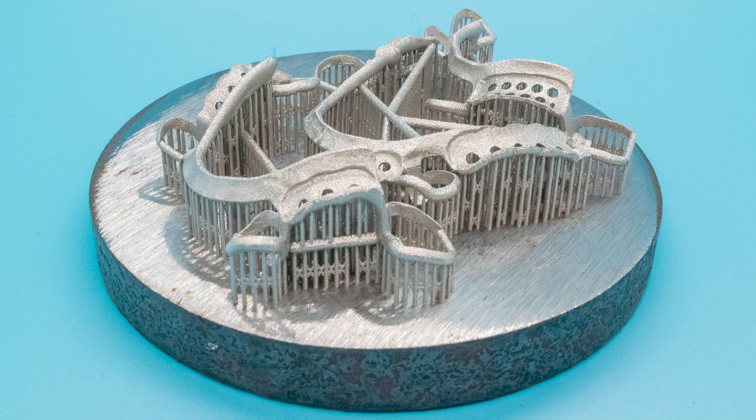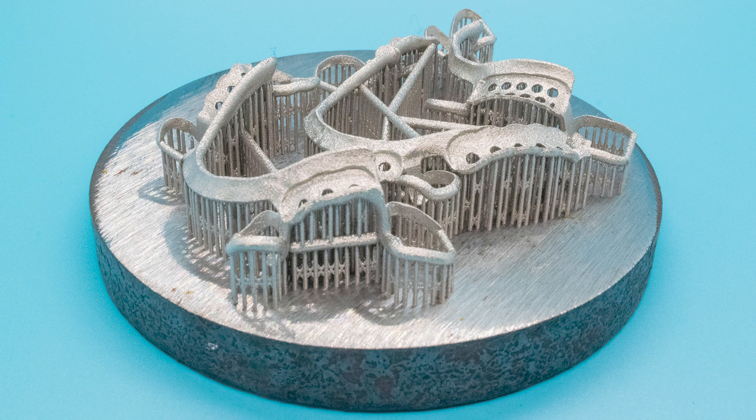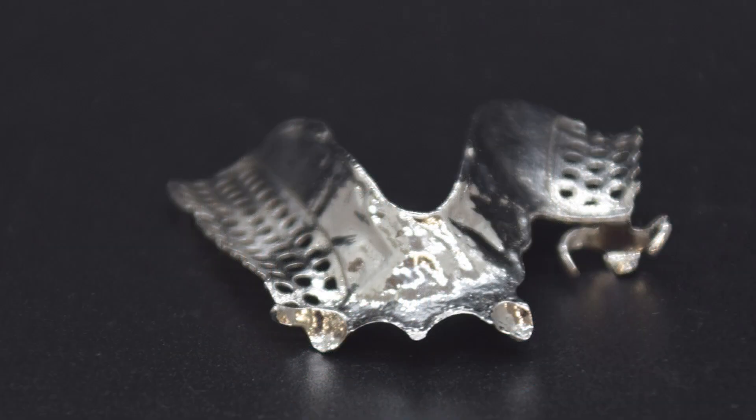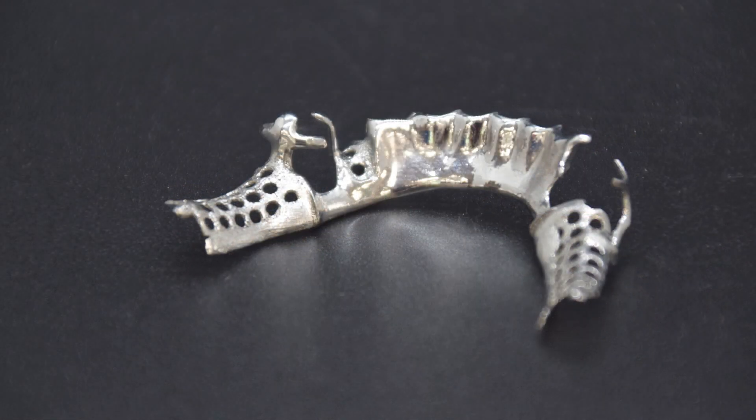Once printed, the frames are annealed and finished. The final prosthesis is completed via press pack with Lucitone 199 acrylic and Arctic teeth - a truly unique fusion of traditional and digital techniques. Our DMLS metal partials are the new standard for removable partial dentures.